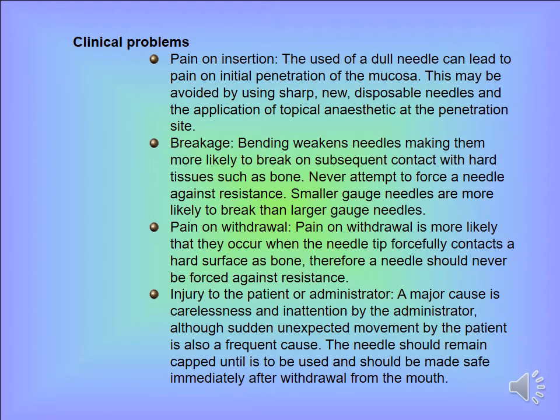The clinical problem of needles. Dental needles can cause pain on insertion. The use of a dull needle can lead to pain on initial penetration of the mucosa. This may be avoided by using sharp new disposable needles and the application of topical anesthesia at the penetrating site.